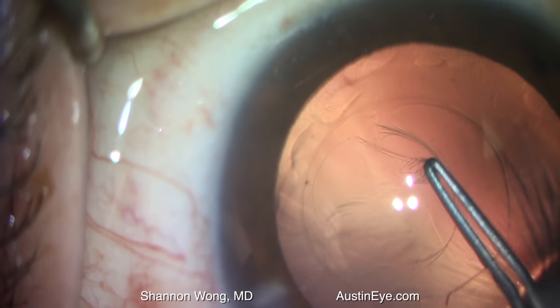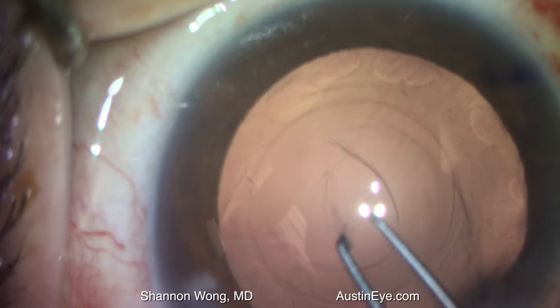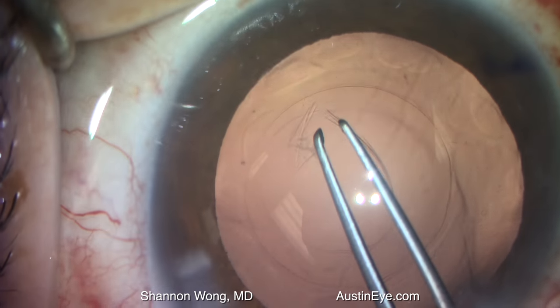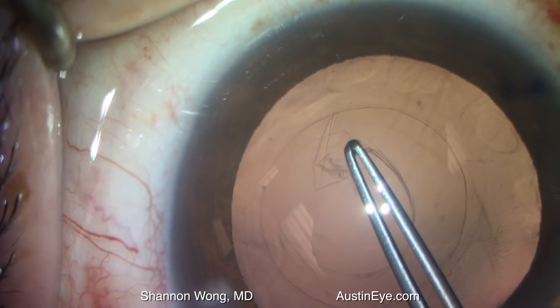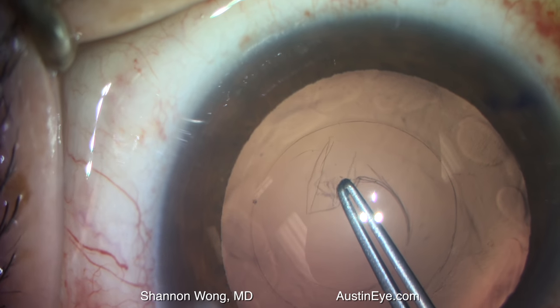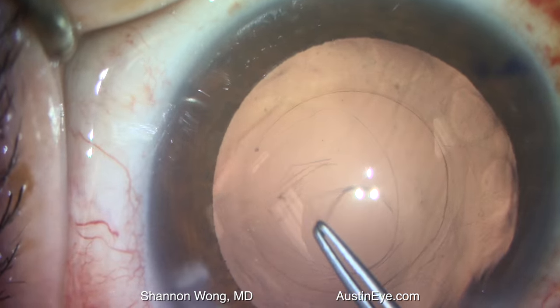The anterior chamber is very stable due to the presence of viscoelastic, and once we have a posterior capsulorexis, we can then continue with planned placement of a symphony toric lens into the capsular bag.